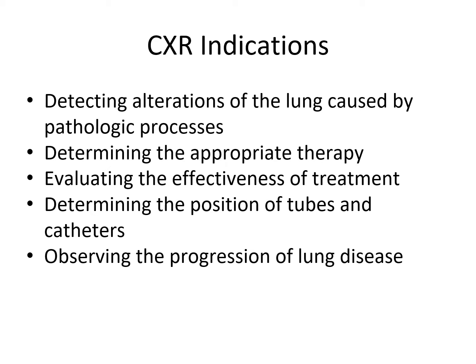We also want to make sure that we haven't punctured the lung with putting in certain lines, and again looking at the progression of lung disease, and that could be an acute process like a pneumonia or a pneumothorax or pleural effusion, or it could be monitoring a chronic condition such as COPD.